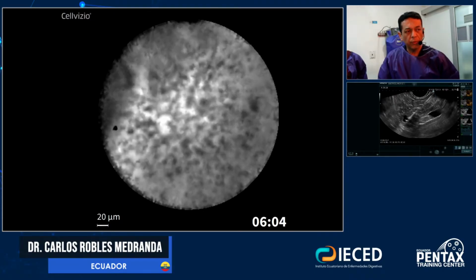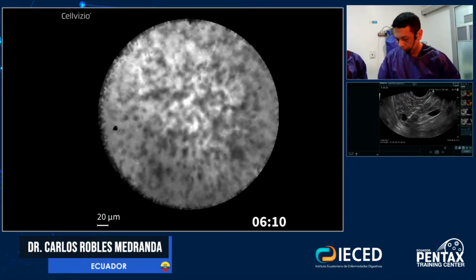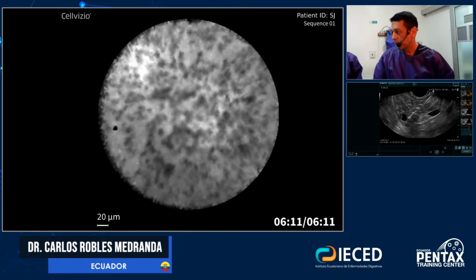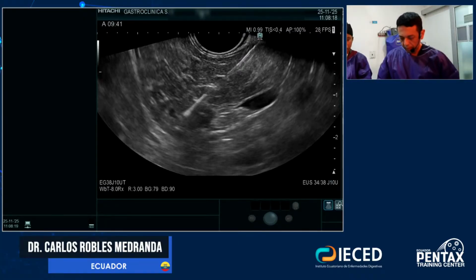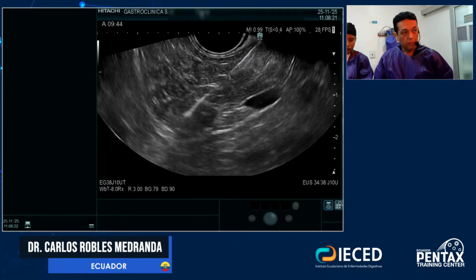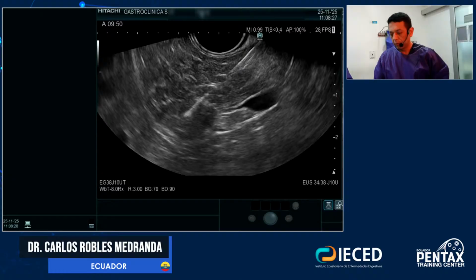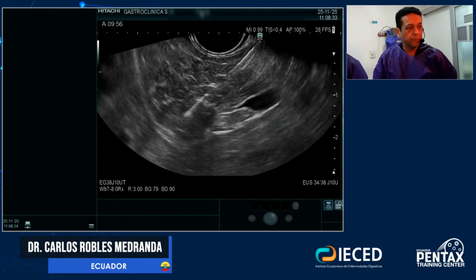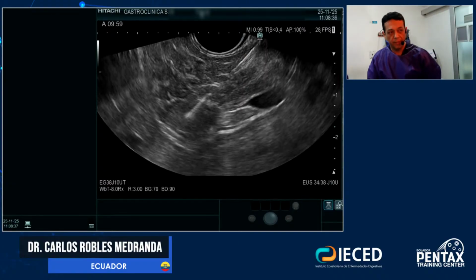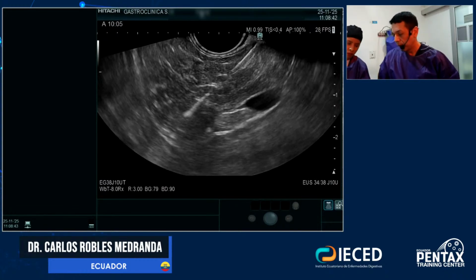Maybe I can try to use the Murray. Yes. Okay. Perfect. So I have very nice image. Pon la imagen del. Préstame una Murray. O no, mejor así, no, sin Murray. Dame solo para aspirar. So I will make an aspiration. I don't have the chance to pass the Murray. That is very important. I said recently about that. No tanto. Necesito menos. Sí.